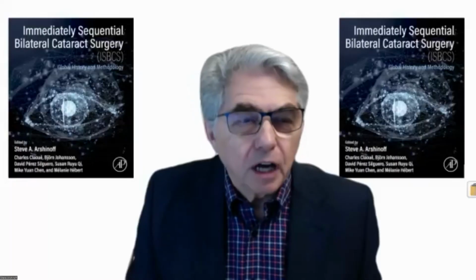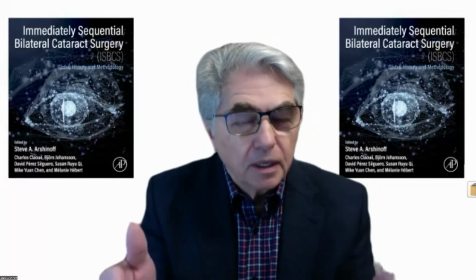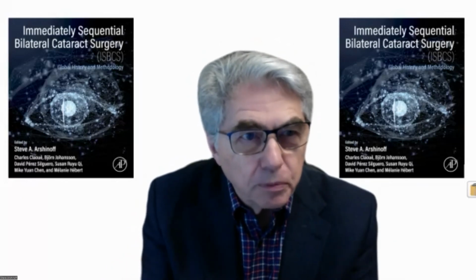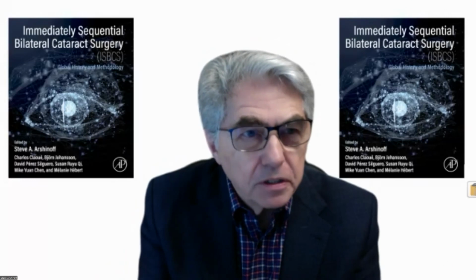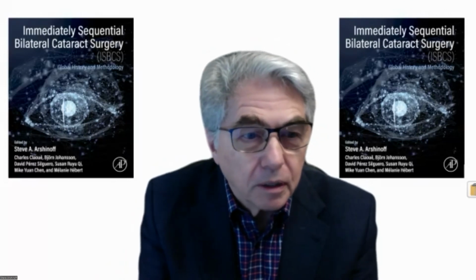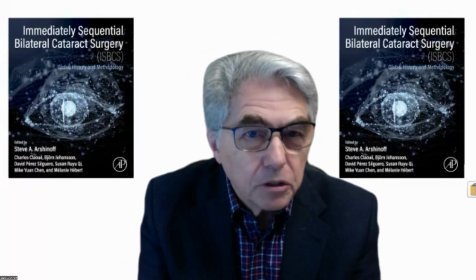Okay, thank you. But your comment on the chamber maintainer is excellent, because I wasn't meaning to criticize India for using HPMC, because it was first made commercially in India. The comment on the chamber maintainer, which came from Blumenthal and from Israel, is actually still a problem in Israel, because they've been taught to use chamber maintainers, and you get more cell loss because you're washing the endothelium with balanced salt throughout surgery, and it's very hard to convince them to change.